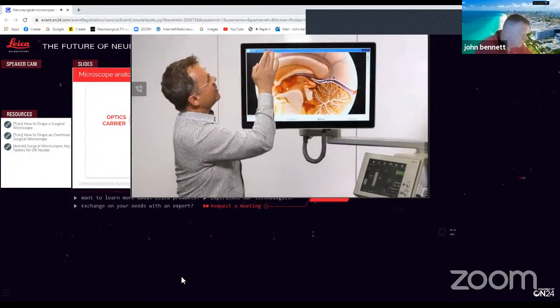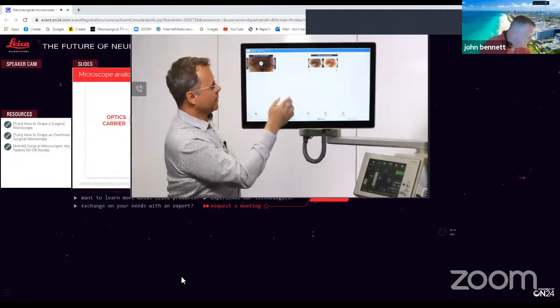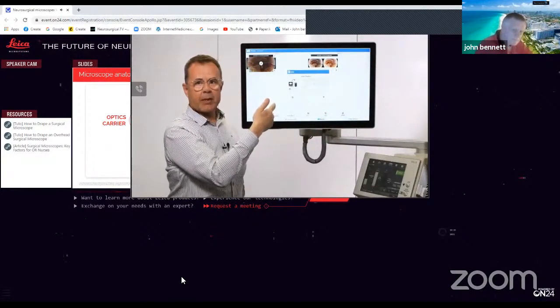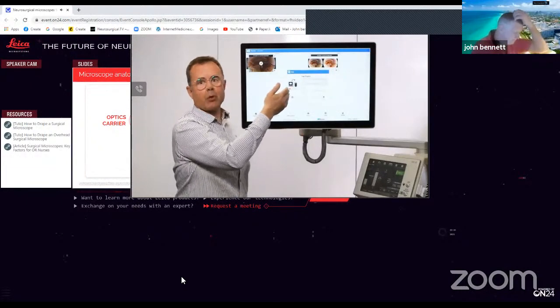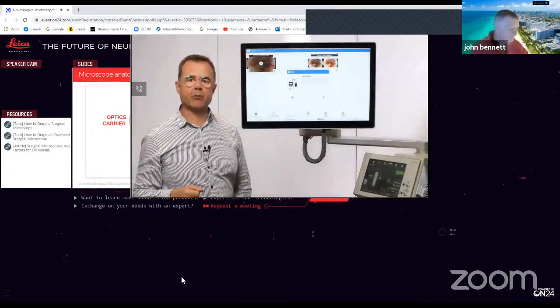If you'd like to export those data, here you have copy. A pop-up appears, and whether it's a USB stick or an HD drive attached to it, it recognizes, and you simply copy it onto it. This is so intuitive and easy, as you know from your smart devices or computers.